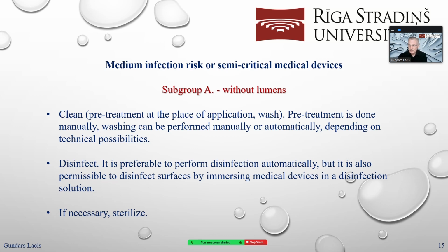This third point depends on you, on doctors, because you know the kind of contact. We who are preparing medical devices, we don't know this contact, but you can inform us, and it would be really nice if you would do this. Inform us what the kind of contact was, and please sterilize also. It can happen.